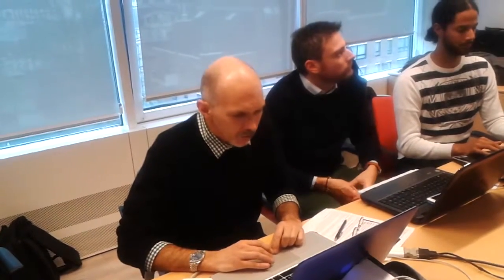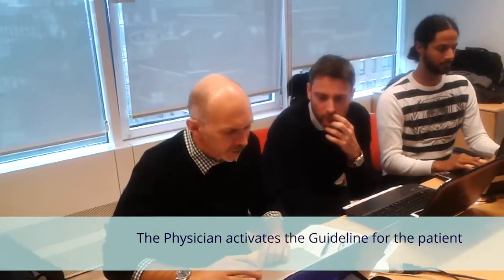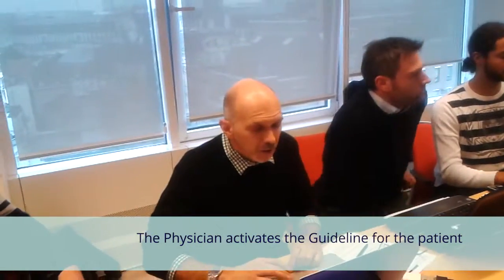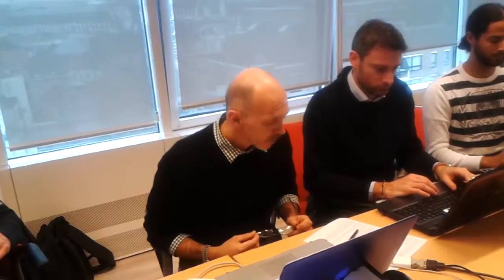At this point we have this prescription with flecainide. We may add a response here. You can see that the guideline is still inactive, and we have to now activate the guideline. Okay, and now we have the guideline ready. So at this point the patient is discharged, and with the MobiGuide system with that scheduled monitoring period, is discharged on antiarrhythmic drug.